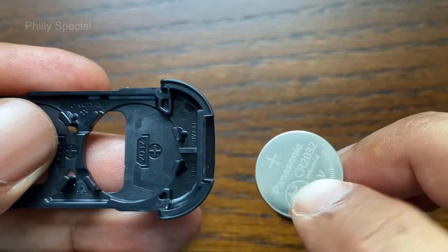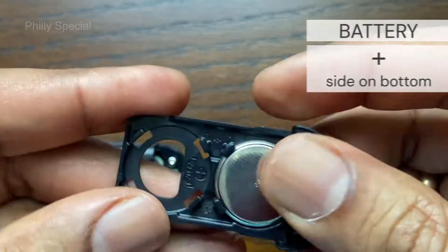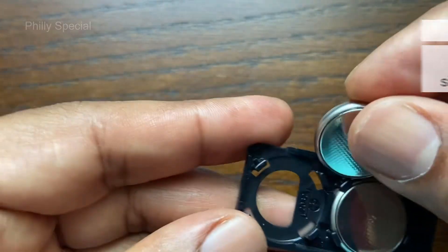The inside of the cover has markings of the battery type and the orientation. With the positive side facing down, place the battery in the compartment and snap it in place.